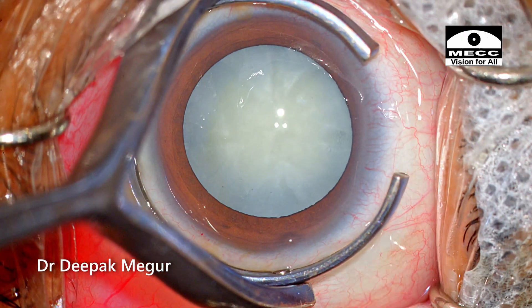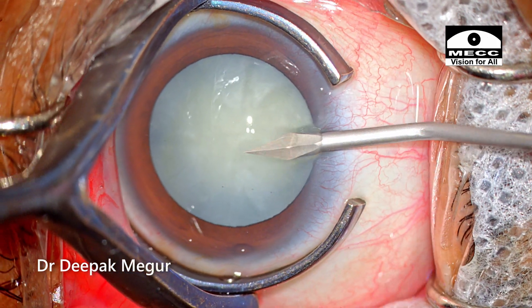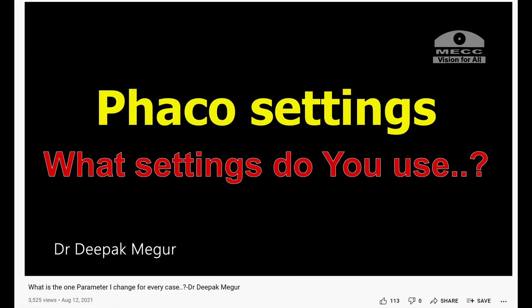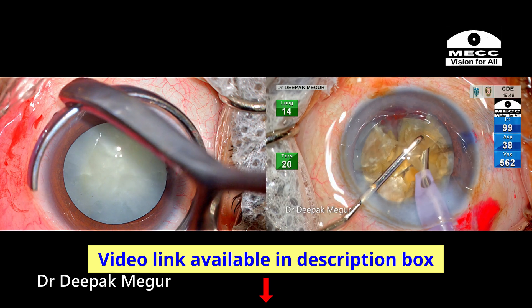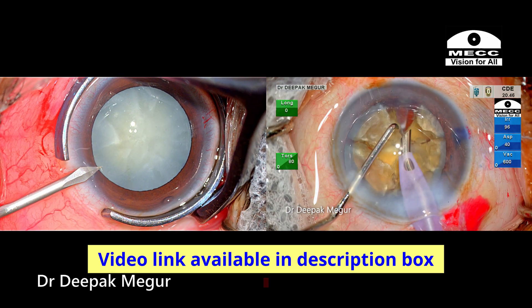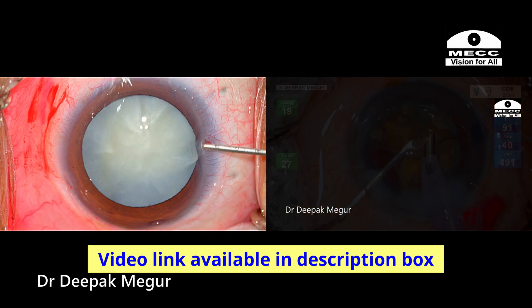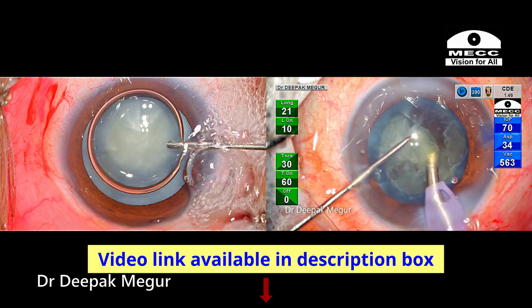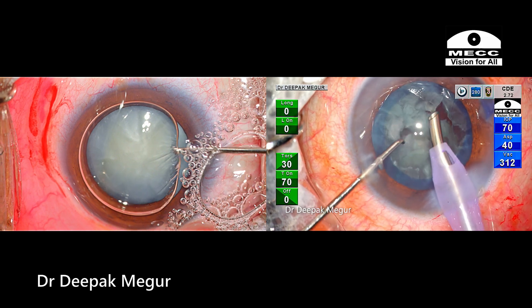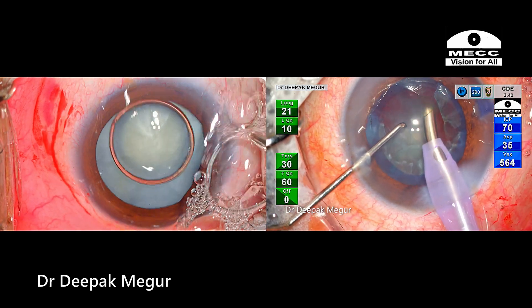As the preliminary steps are being performed, let me remind you all about a video which I had posted some time back, titled 'The Only Parameter I Change for Most Cases.' If you haven't had a look at it, please do check it. FACO power settings is the one parameter I change frequently depending upon the hardness of the nucleus. In this case, we are going to see how important it is to titrate the energy delivery appropriately in every case.